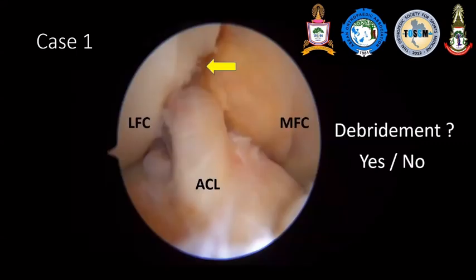But arthroscopic visualization shows something like this — an ACL stump there, just only some missing soft tissue. Will we debride or remove the stump? I will have the solution in this case, my case, in the final.